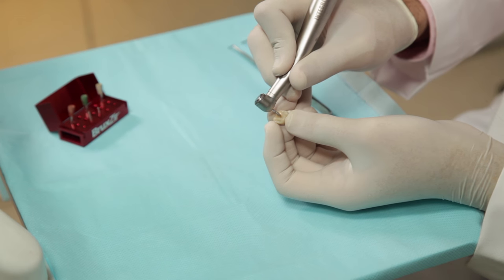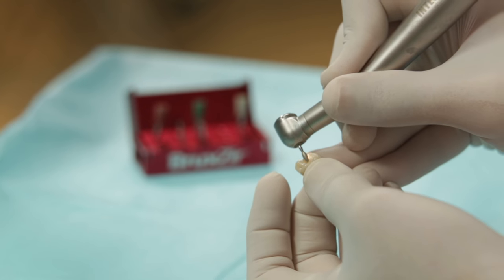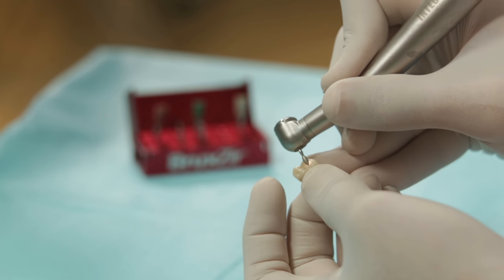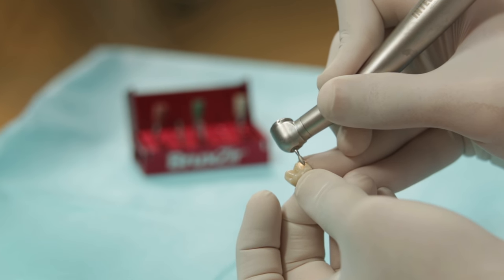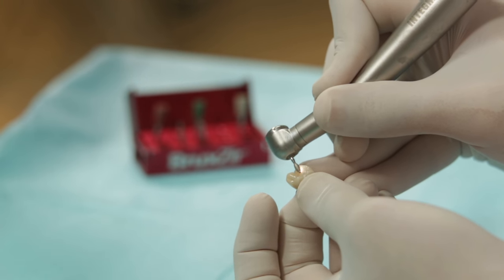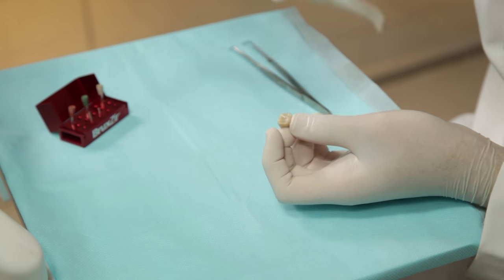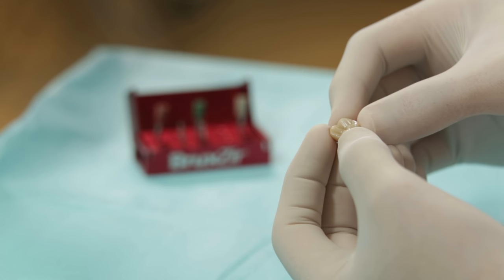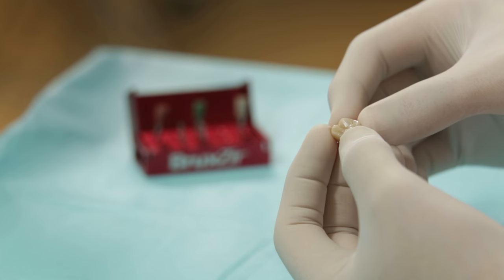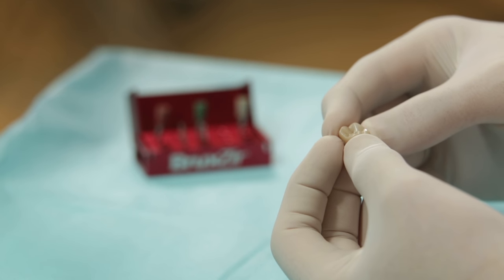We need a fine bur and not a coarse one for cutting through or adjusting a Bruxzir crown. I have a Bruxzir crown here and I am going to use the flame shape bur, assuming that this crown needs some occlusal adjustment. Now even though this is a fine diamond, you can see that there are some sparks flying. It's extremely important to keep the water going, especially when you are adjusting the crown inside the mouth. You can see that I have abraded this part of the crown with the bur — I have exaggerated that for us to visualise better.